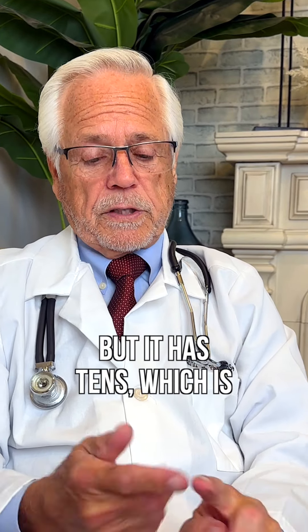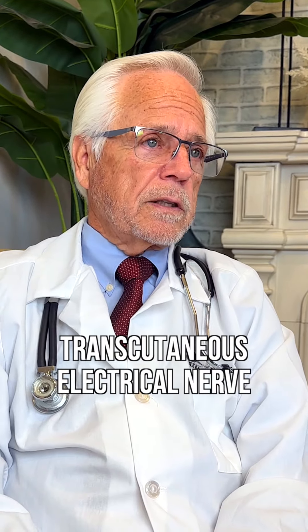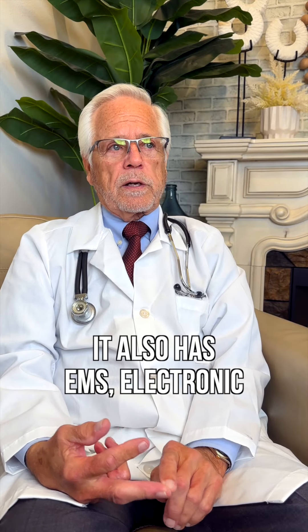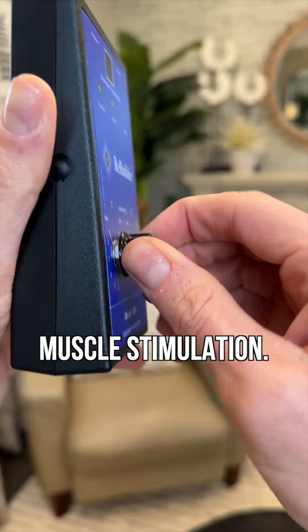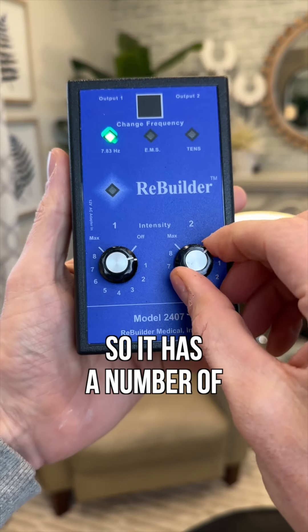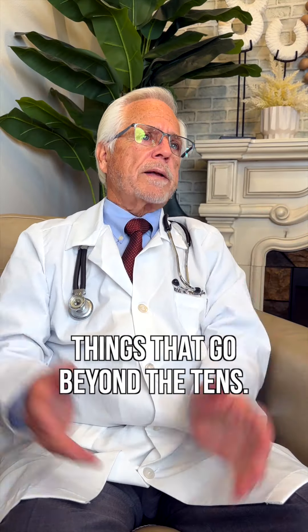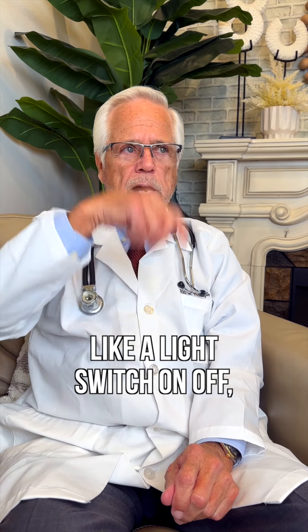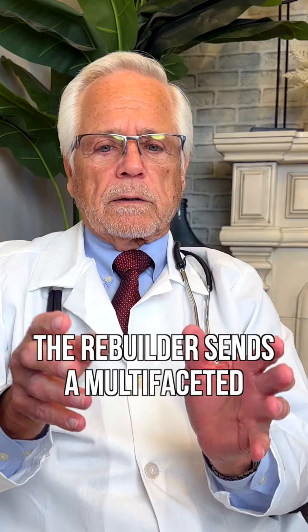But it has TENS — transcutaneous electrical nerve stimulation, that's nerves — it also has EMS, electronic muscle stimulation, and PEM, pulse electromagnetic frequencies. So it has a number of things that go beyond the TENS. A TENS sends a square wave, like a light switch — on, off, on, off — whereas the Rebuilder sends a multifaceted waveform.